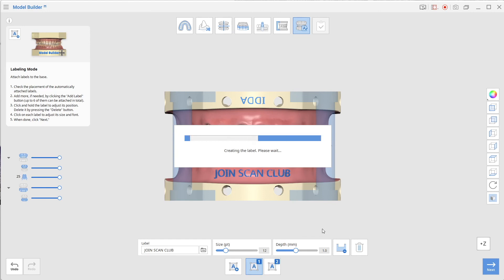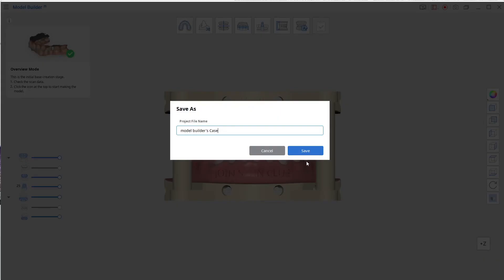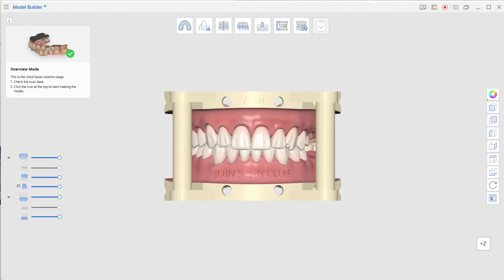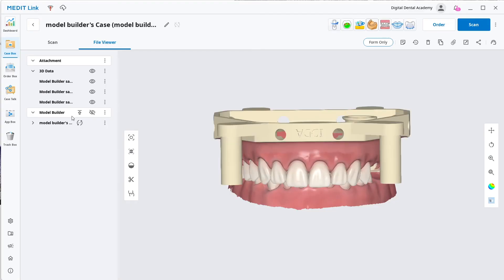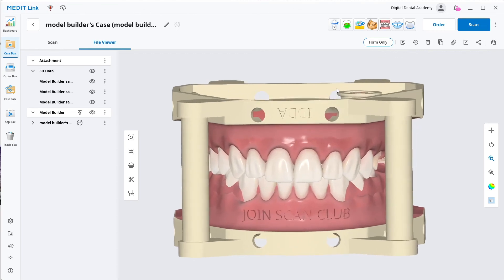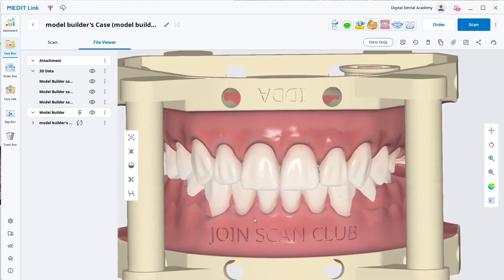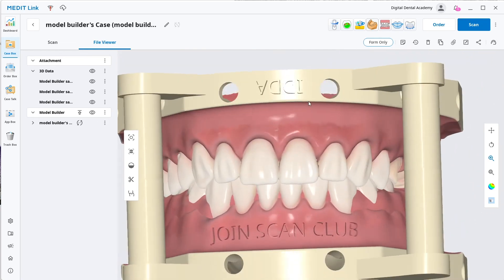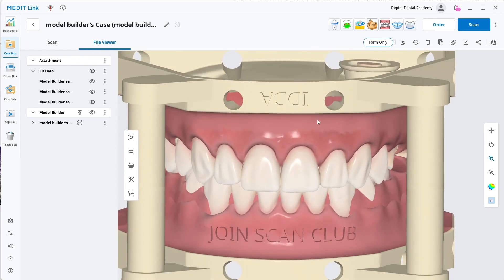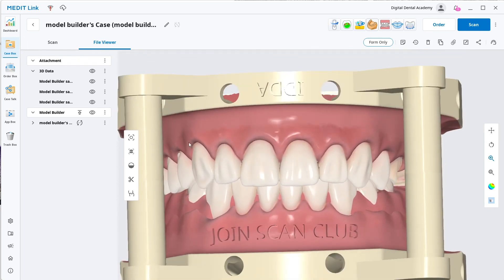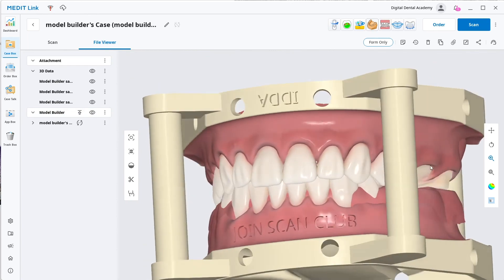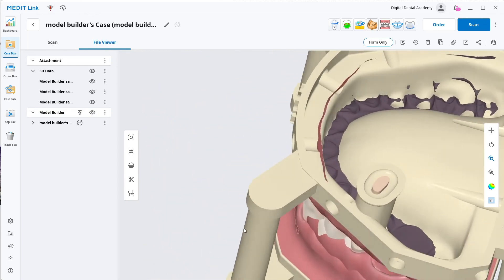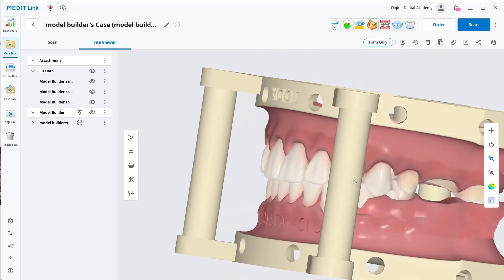Otherwise that's it, done. We'll click the tick at the end of the workflow, it'll create the labels, it'll create the articulation pins with the correct attachment between them. I'm going to save it and it's already saved once because I've run through this before, so that's okay. You can see it generates it here and we can see that is all good. Now I'm going to zoom in so you can see the effect of the two different types of either embossing it or carving it into the model at the bottom. You can see at the top it's embossed so it's sticking out from the model, and at the bottom it's carved in there so it's within the actual model itself. Me personally I actually prefer it carved in, and the reason why is because it seems to be more reliable for printing depending on the printer obviously.